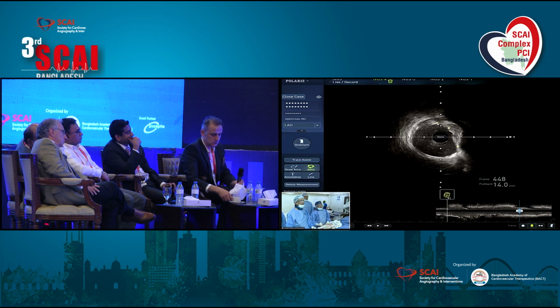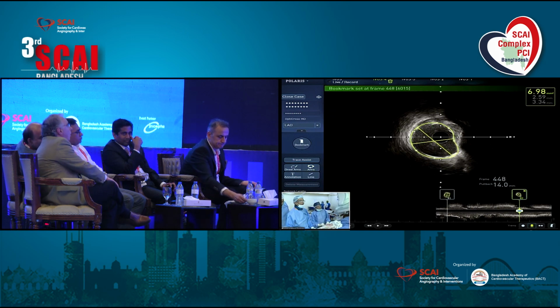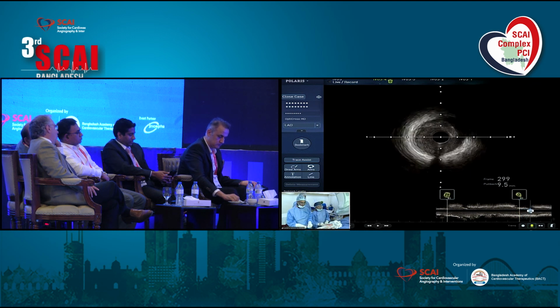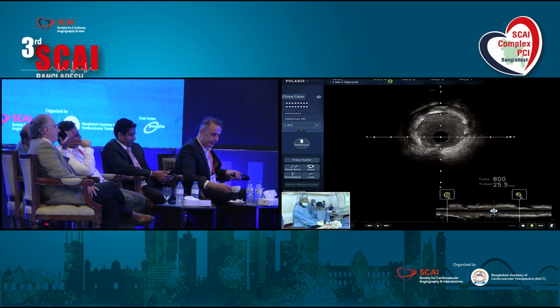And then we were able to stent it and show that based on IVUS, how we were able to post-dilate as need be, so that we don't have to be really too aggressive in post-dilatations as well. And we also said that there was a disparity between the size of the vessel, but we were able to do that with the one stent.